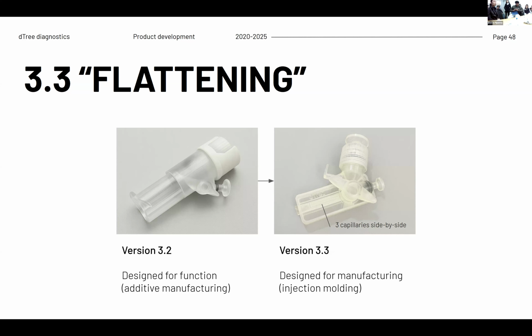So for the wet reagent, we used to store them in capillaries. You can also see capillaries, literally just glass capillaries, stored in the device. We had that like this too, where we wanted to do a multiplex chamber, but with three distinct capillaries in there. We tried that.